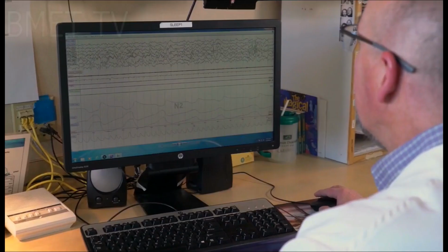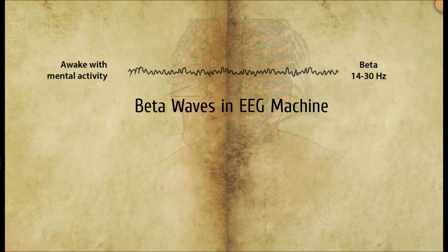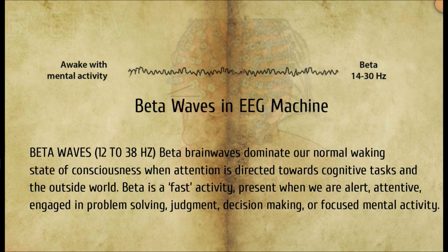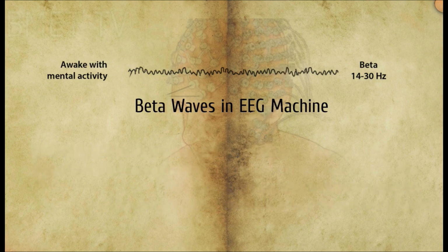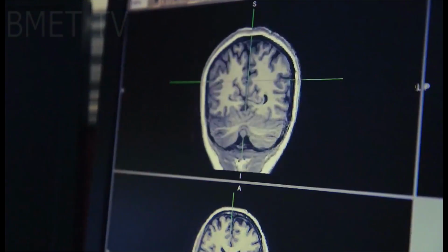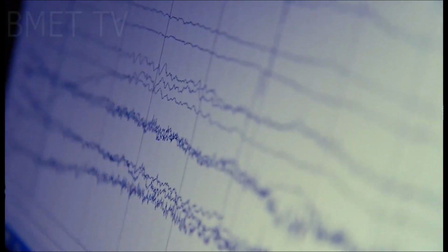Fourth is beta waves. Beta activity is fast activity. It has a frequency of 14 and greater Hertz. It is usually seen on both sides in symmetrical distribution and is most evident frontally. It is accentuated by sedative hypnotic drugs, especially the benzodiazepines and the barbiturates. It may be absent or reduced in areas of cortical damage. It is generally regarded as a normal rhythm. It is the dominant rhythm in patients who are alert or anxious or have their eyes open.